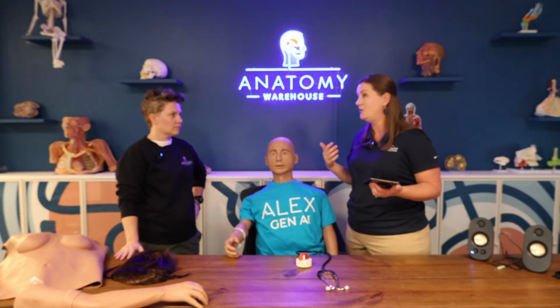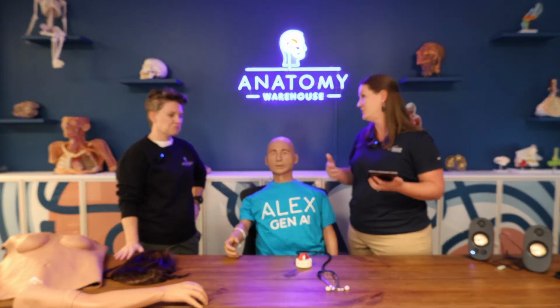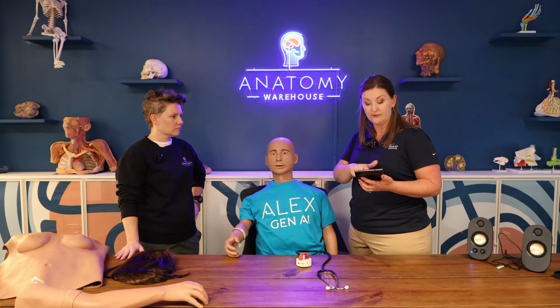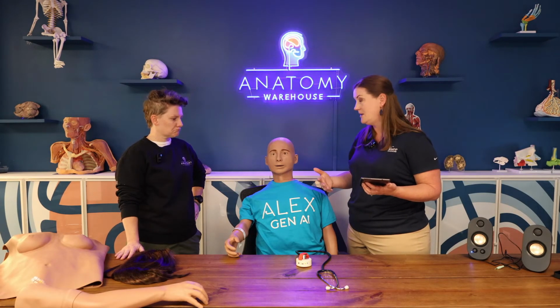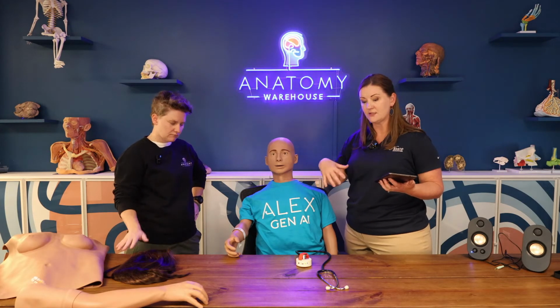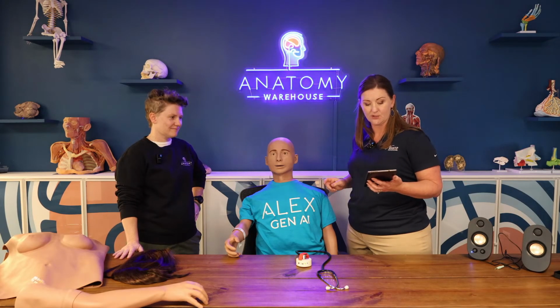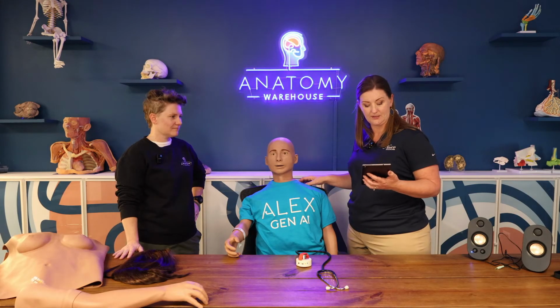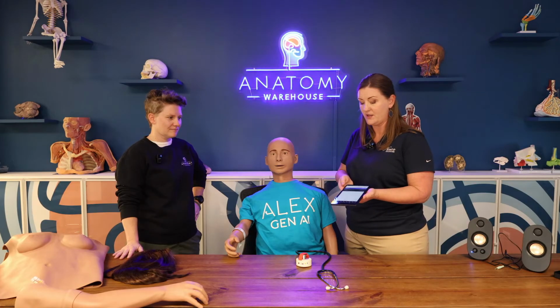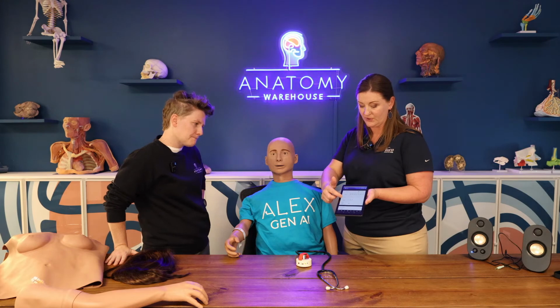who is a new patient into a clinic, and she's just there to get a new doctor. She might be new in town. The conversation can flow as normal. She's relatively young and healthy, so we'll start with Vivian, and then I can show you how the auscultation smart scope works and some added features related to the smart scope. But we'll get her going so that we can start talking with the mannequin as it's ready. So simply within that software platform, it automatically pops open to your vital signs parameters, which is really, really nice.